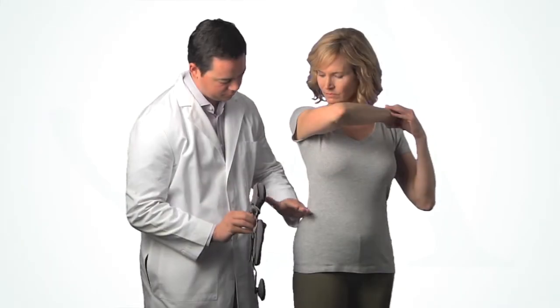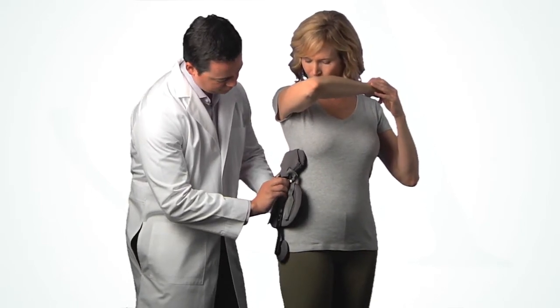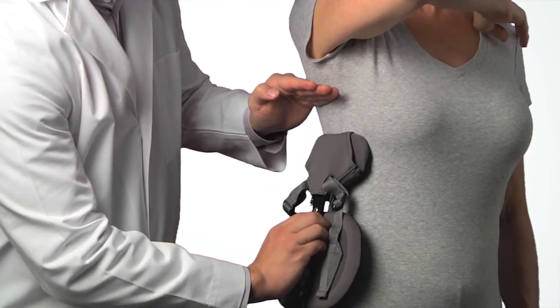To apply, first determine which side of the patient should be supported — for this video, it will be the side with the lower shoulder. Place the universal strut assembly against the patient with the iliac pad just above the iliac crest. The thoracic pad should be approximately two inches beneath the patient's underarm to avoid discomfort when seated.